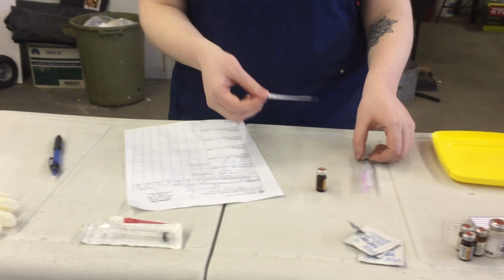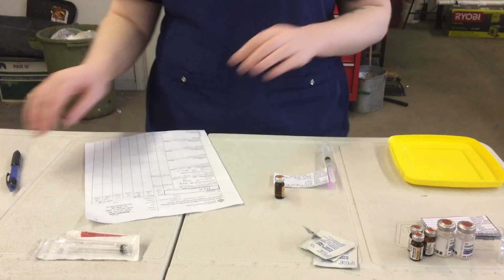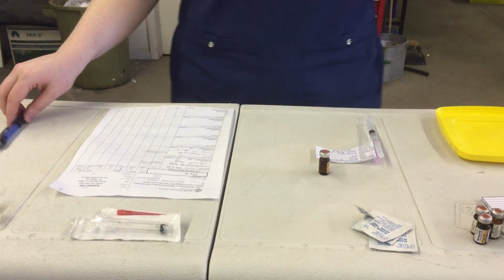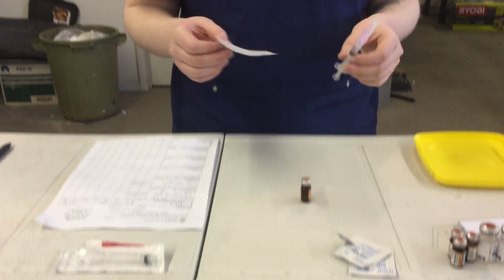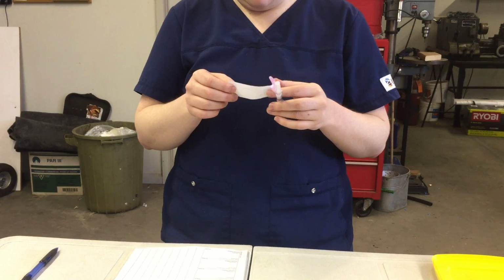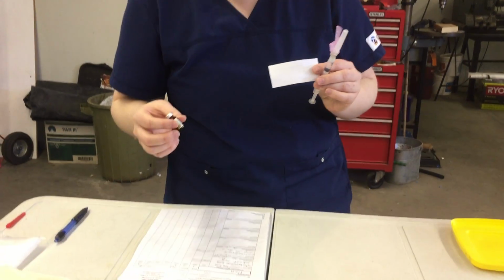So after I've done that, I'm just going to attach this to the cap of my needle here. I don't have the right sticky labels, but I would do that in a real setting. So after I've done that, I'm just going to go ahead and do my second check here. So we're going to be taking my syringe here, my label and my MAR and my medication and just doing a second check here.